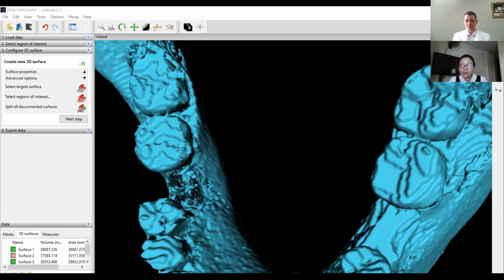Rồi thêm một ý nữa là bác sĩ TH ha, nếu mình giải thích với bệnh nhân như thế thì bệnh nhân sẽ nói là họ không muốn nhổ răng, vì bác ấy đã làm việc ở Campuchia, bệnh nhân ở Campuchia hầu như không ai muốn nhổ răng hết. Thì mình sẽ đưa file này cho bệnh nhân xem, chỉ cho bệnh nhân thấy đây là khoảng mình cần đưa vào, mình cần đưa vào chừng này, mà không nhổ thì mình không thể làm được.